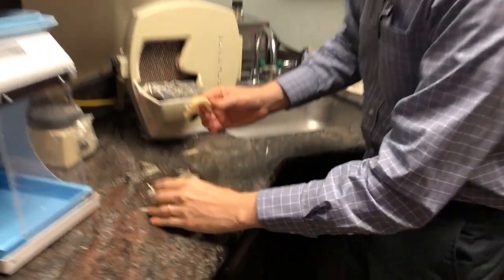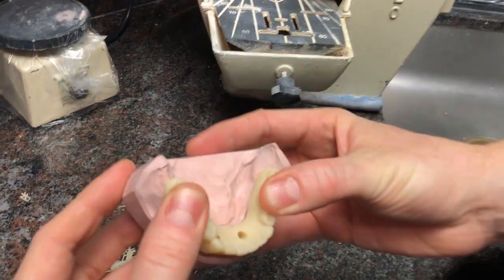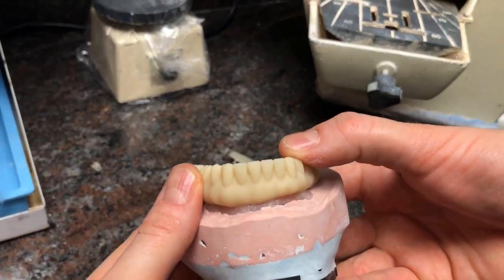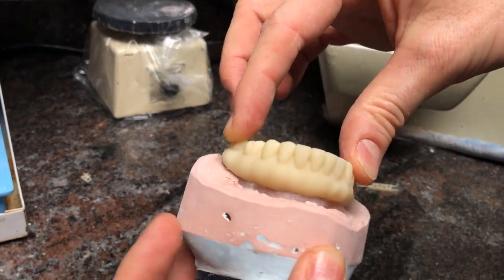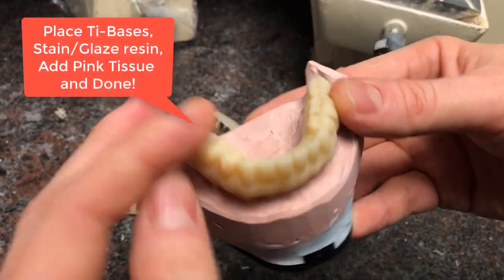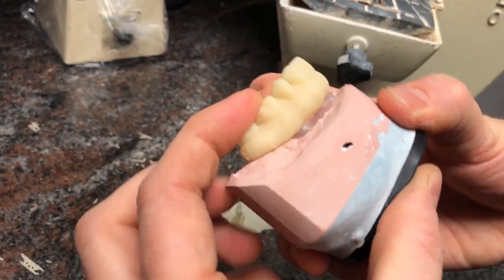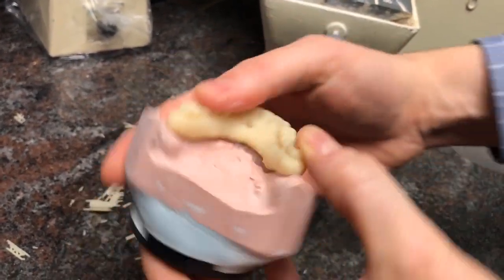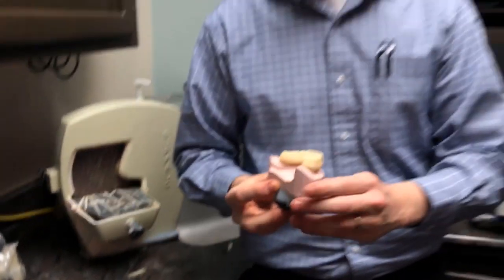I went ahead and removed the supports — moment of truth — and perfect fit! All I need to do now is pop in my little ti-bases to fit on top of my multi-unit abutments. Take a look: my Anycubic Photon print fits perfectly on my dental model. Extremely promising.